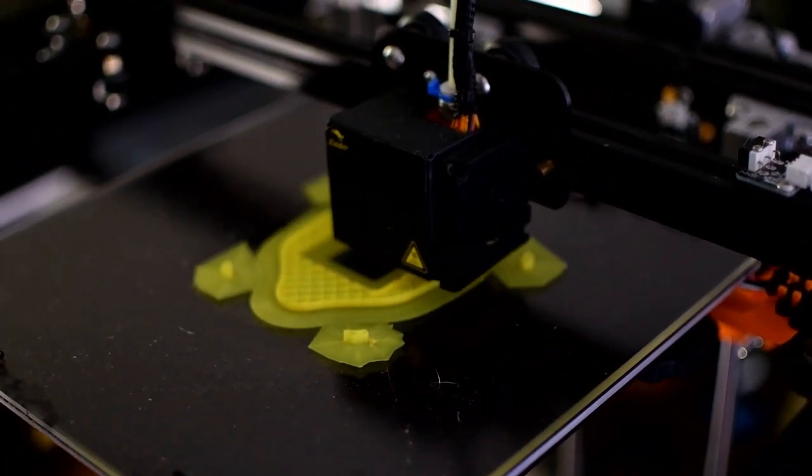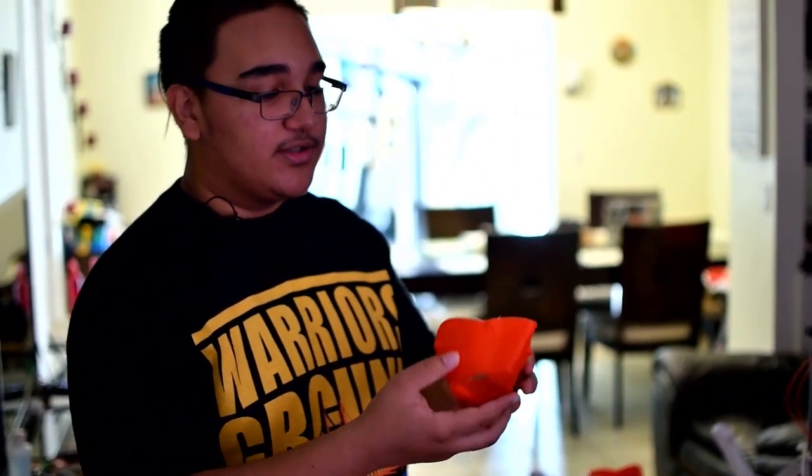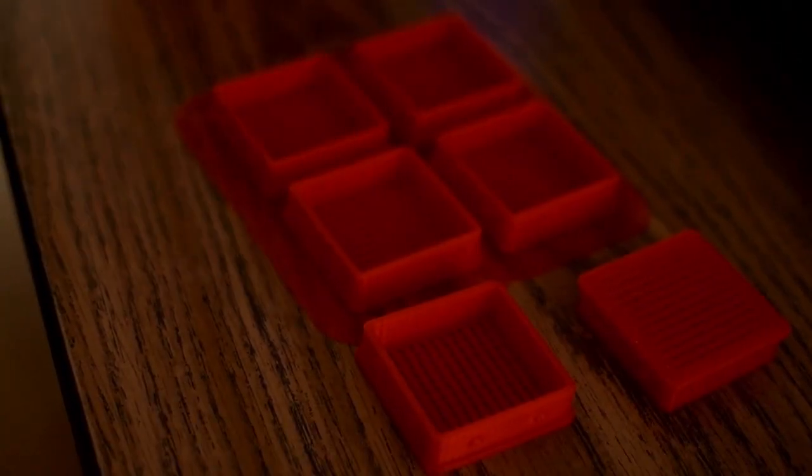So we took an open source file which everyone can download if you have a 3D printer. This one was more efficient because there's three sizes — small, medium, large — and it's the same idea. There's the filters.